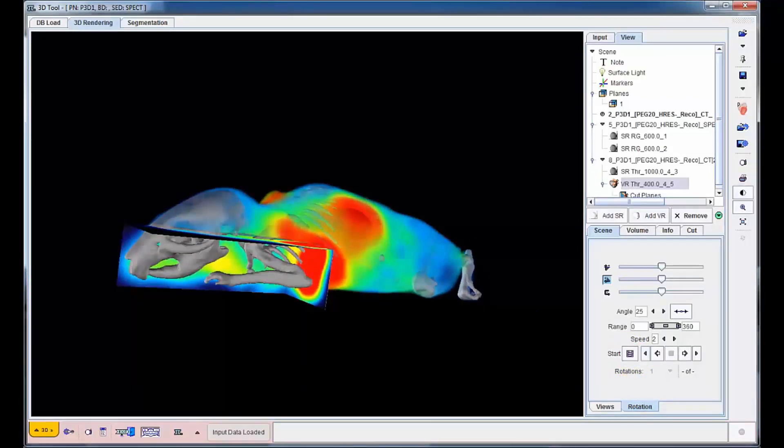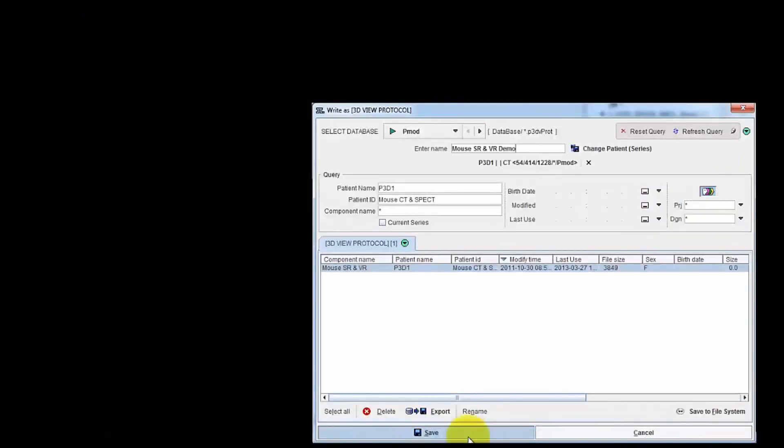As a final step, a protocol file can be saved to allow rapid reproduction of the current rendering at any time later.